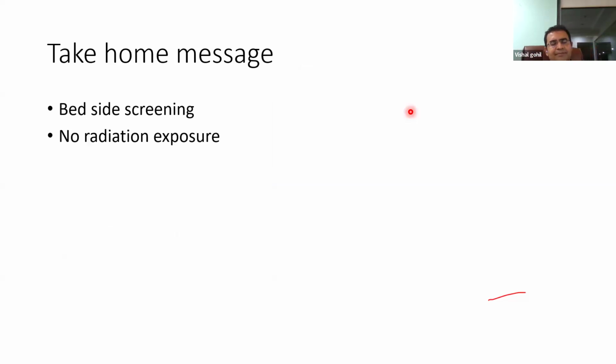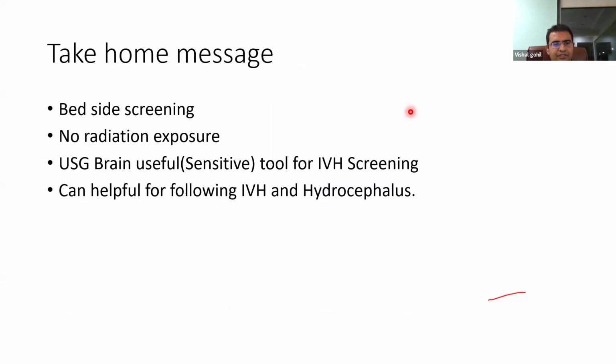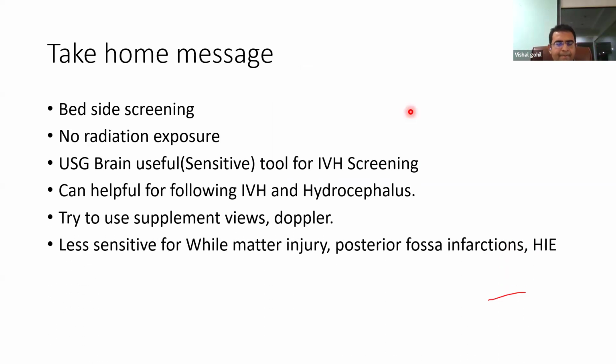You can do multiple ultrasonography at bedside. There is no chance of radiation exposure. It is the most sensitive tool for IVH screening, and it can be helpful to follow the IVH and the hydrocephalus.